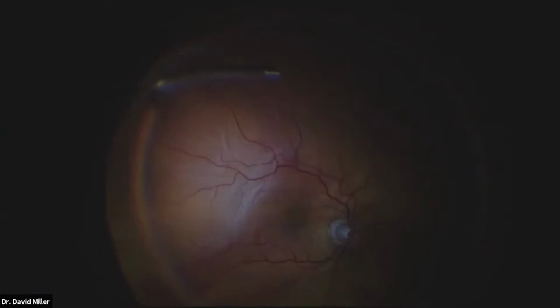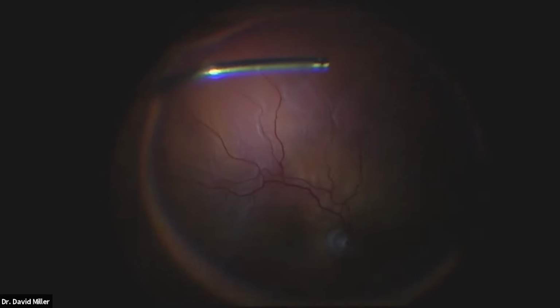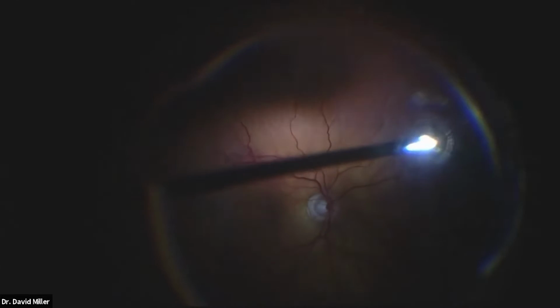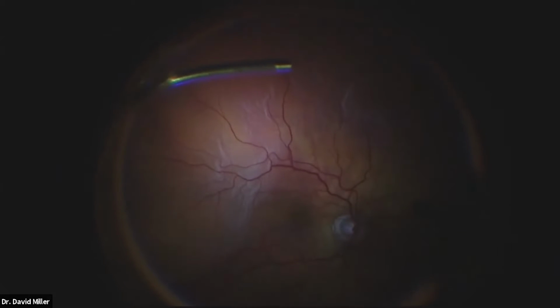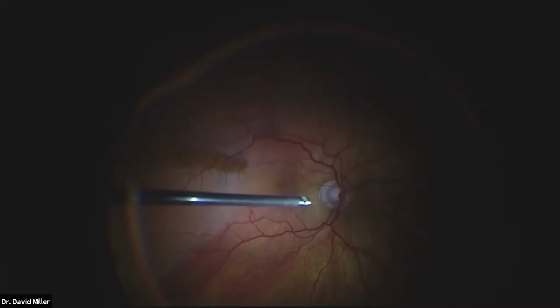What gauge? I prefer the 25 gauge. I do pretty much all my retinal surgery on 25, actually all of my retinal surgery on 25 gauge. Why do I like that? Small wounds, no sutures for closing. Instruments are functional enough, even though they're thinner and more flexible. I just like the smaller wounds. I think it's a good instrumentation.